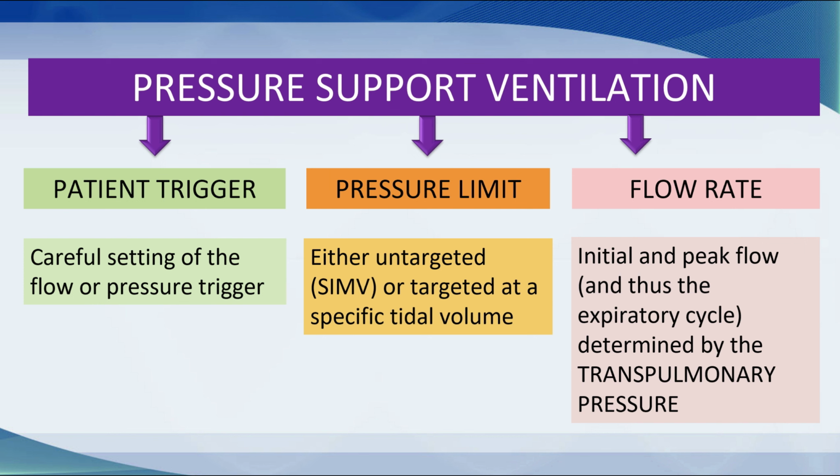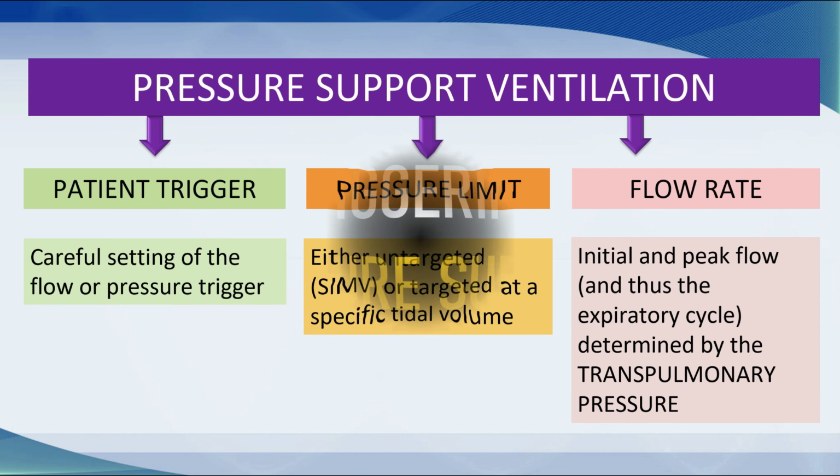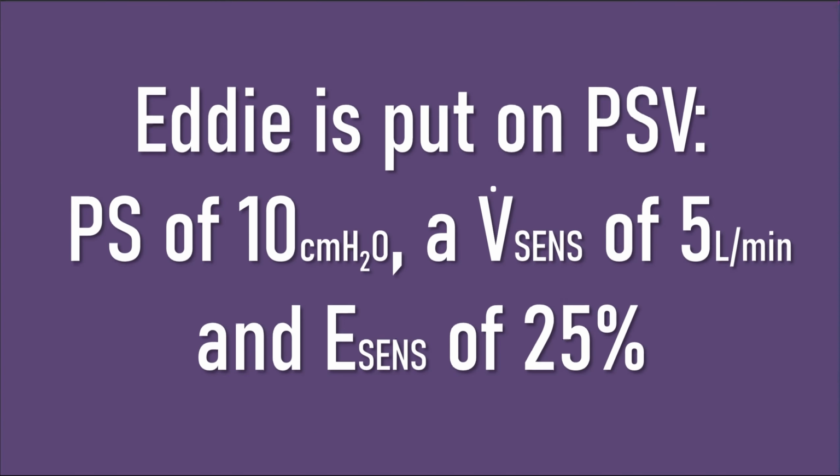And this is often forgotten by the operators of ventilators who are using pressure support. So I'm going to cover this vast swathe of stuff in these 2 tutorials. The first thing, though, that I'm going to talk about is triggering. We discussed triggering in tutorial 3. I'm going to go into it in slightly more detail here because really you can't understand pressure support unless you understand triggering. So Eddie has put on pressure support ventilation.